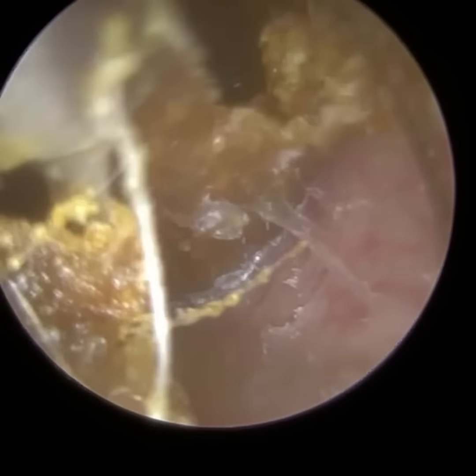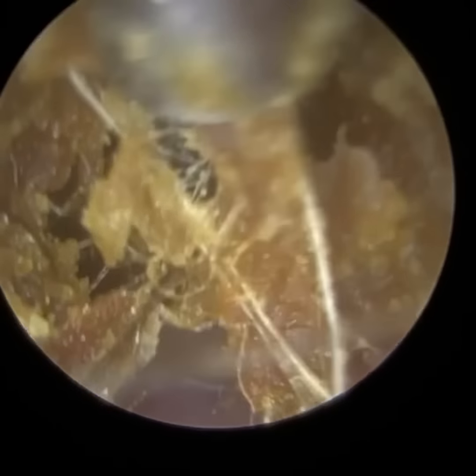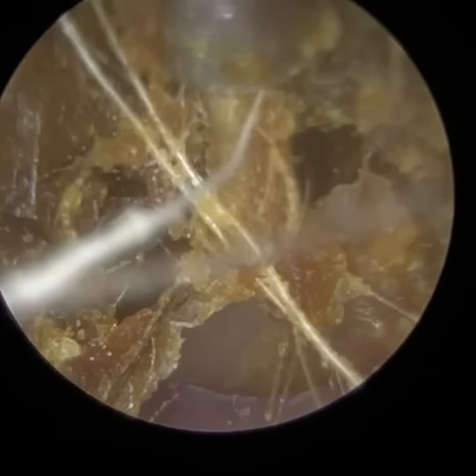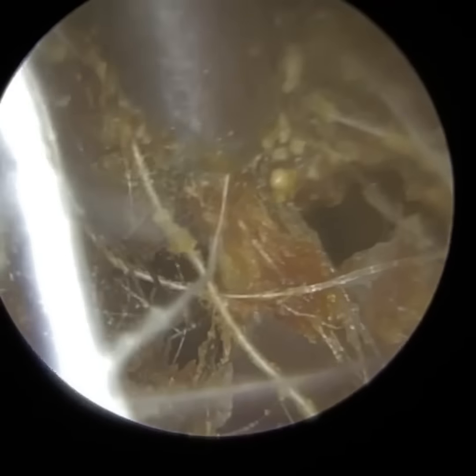The inner two thirds of the ear canal, the bony part, has the thinnest layer of skin, less than 0.1 millimeters in thickness, and there are no hair follicles found in the bony portion. So you can see as we enter the ear beyond the outer third, there are fewer hairs. These hairs extend from the entrance and have just stuck themselves to this dead skin that the patient's got. So let's explain what's going on here.